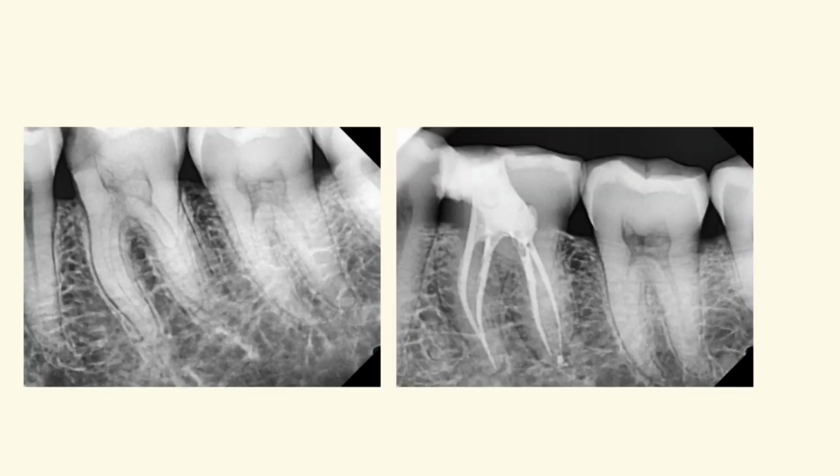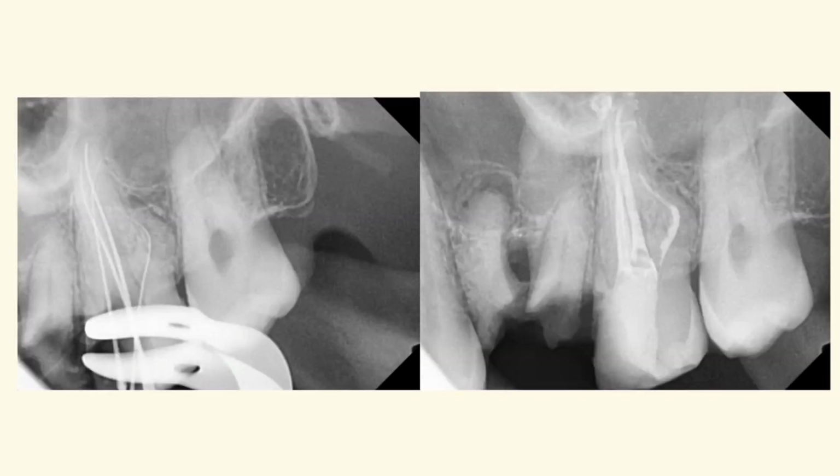This is another case, very long roots, about 25 to 26 mm of working length. Maximum time is spent on the initial negotiation and glide path preparation of the canal. This is a case of confluent canals in the mesial root. The same protocol is followed, resulting in proper glide path preparation and predictable endodontics.